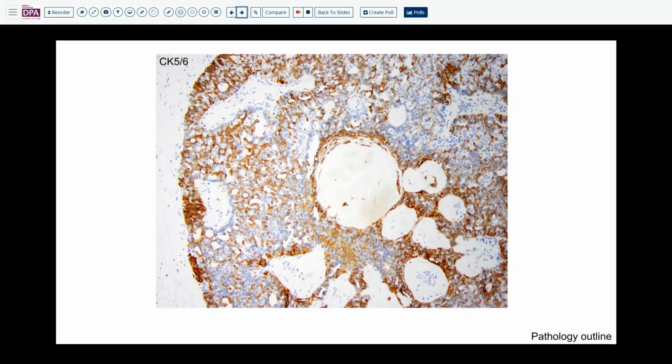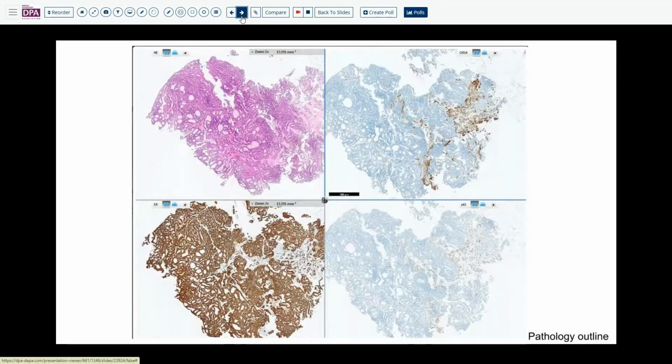And then let's see, I have some staining here. Yeah, this one is the CK5/6 to highlight the myoepithelial cell layer in the intraductal papilloma. So you can see in the periphery we have this brown positive CK5/6 cell highlighting the myoepithelial layer. And then inside in this lumen around the fibrovascular core, we also have this CK5/6 brown staining. So that means this is totally benign intraductal papilloma, maybe with UDH.